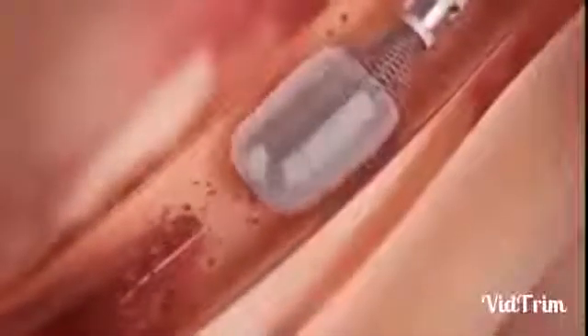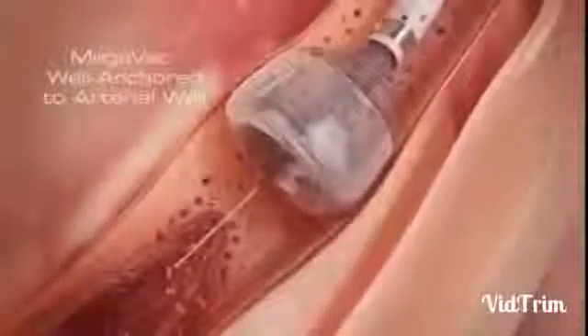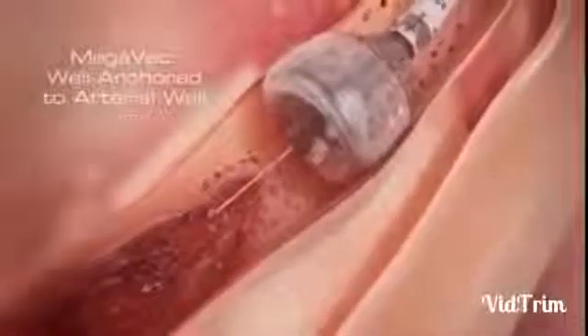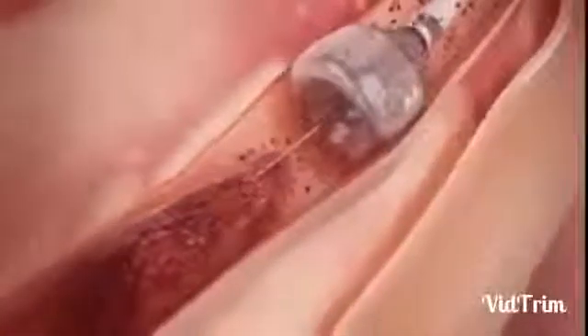The patient's blood pressure, along with the radial force of the funnel tip, combine to press the device against the arterial wall, anchoring the catheter firmly and safely. The outward expansion of the Megavac anchors and centers the device, and can be used as an anchor for other devices in crossing tight lesions or tortuous vessels.